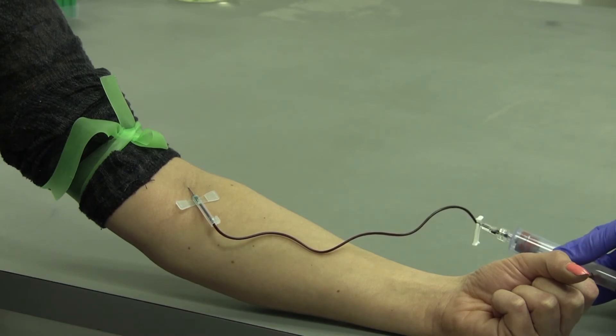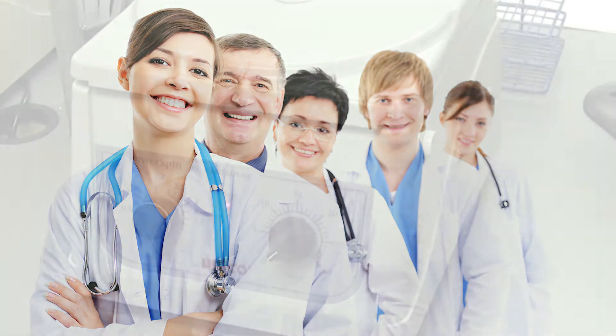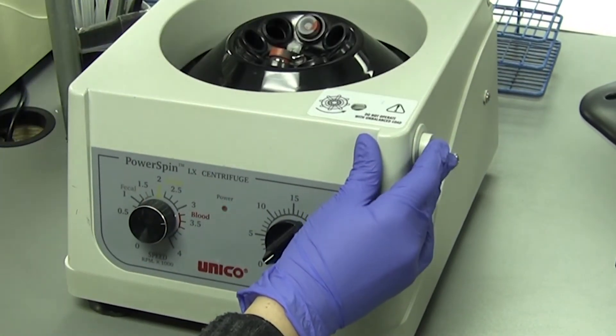After the blood is collected, the phlebotomist or practitioner will spin the serum separator tube in a centrifuge. Spinning the blood in the centrifuge allows the serum separator tube to separate the blood serum from the red blood cells, which is a very important step.